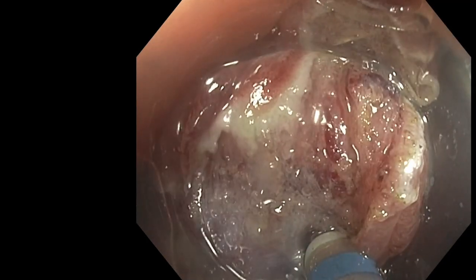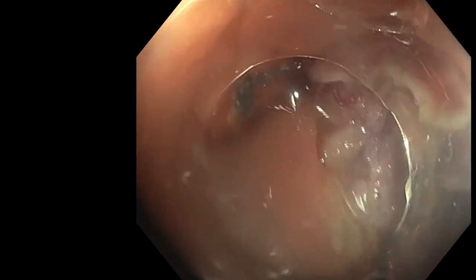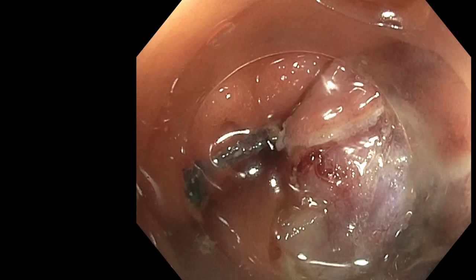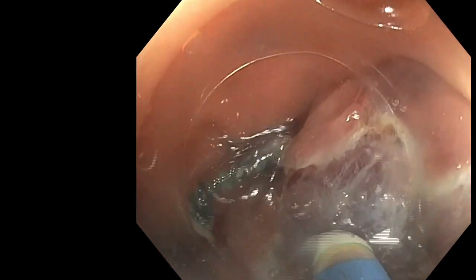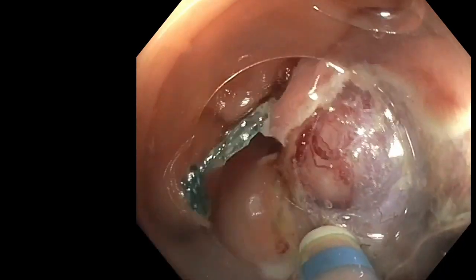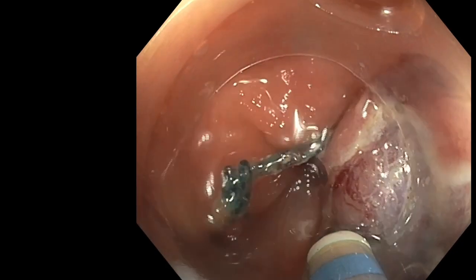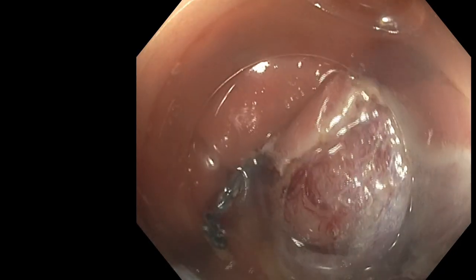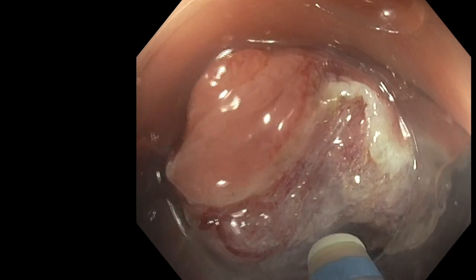So after this, we will try to turn around the diverticula. The diverticula is in the middle, and we will try to cut the submucosal fiber, re-injecting and re-injecting again, to cut only the blue area, and you will see progressively we will enter into the diverticular space.